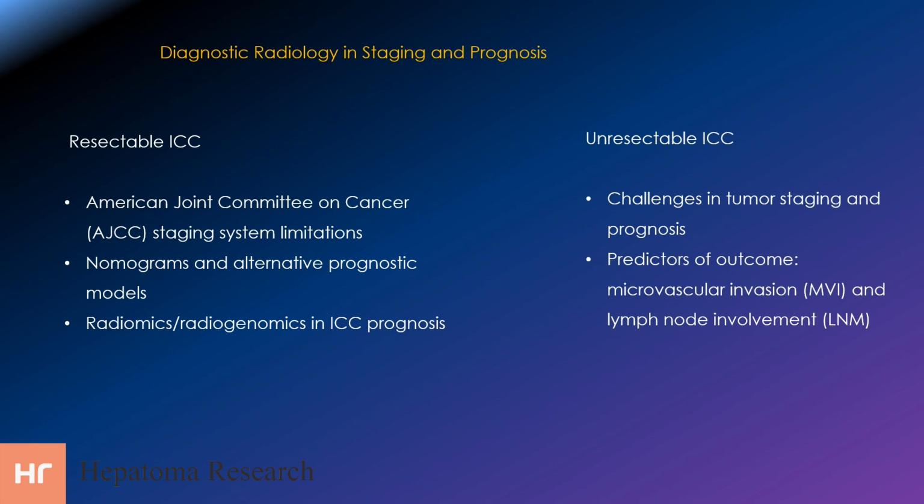Lymph node involvement and microvascular invasion are important predictors of prognosis in ICC. MVI, which currently can only be identified through postoperative pathology, is crucial to predict before surgery. According to recent studies, diffusion restriction and ADC value on MRI have been associated with MVI, and certain MRI quantitative features have been used to evaluate MVI.